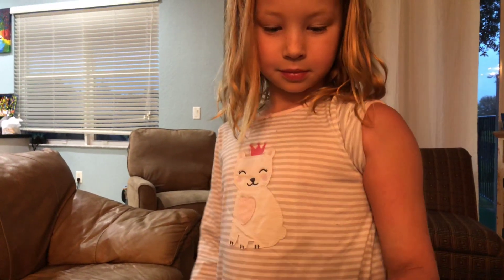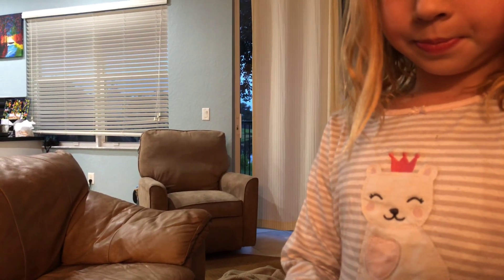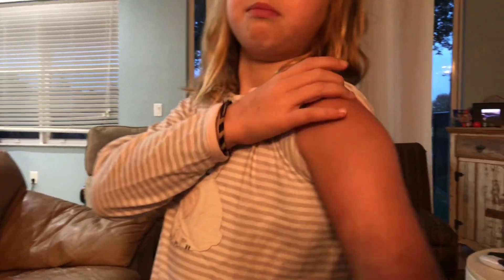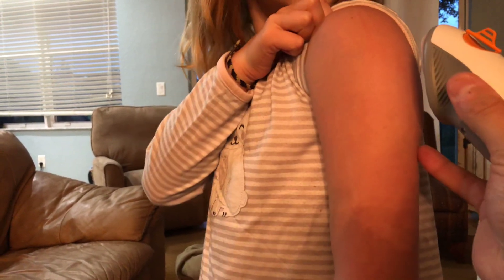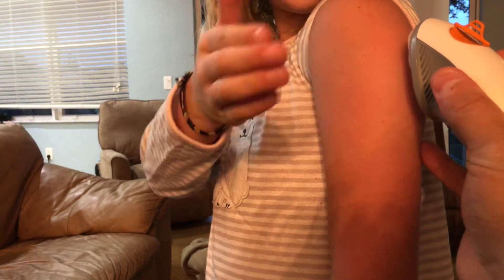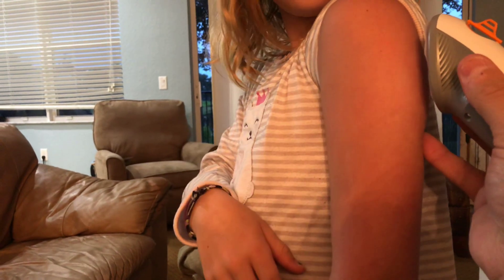So take off the adhesive backing. This is actually my first time putting my G6 on my arm, right there. I'm going to go down to the left — let me lift up. Okay, good.